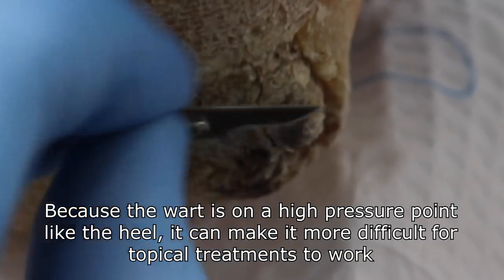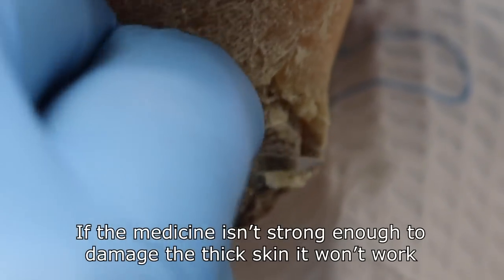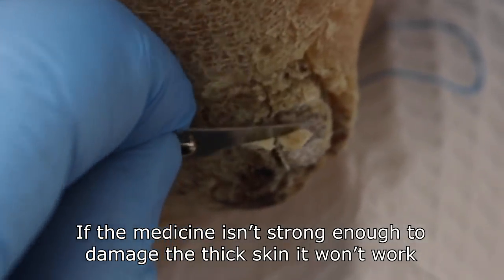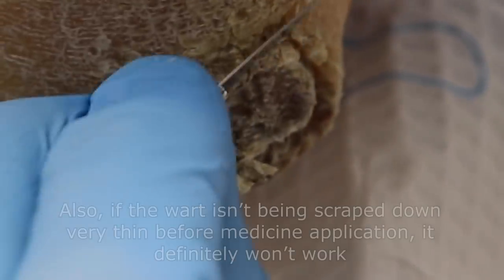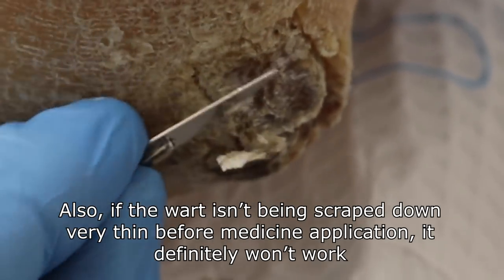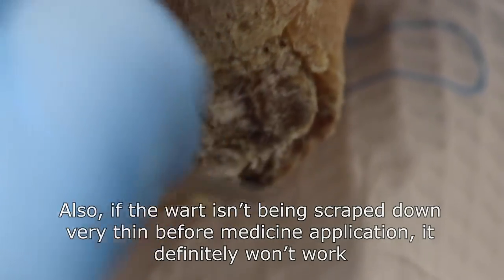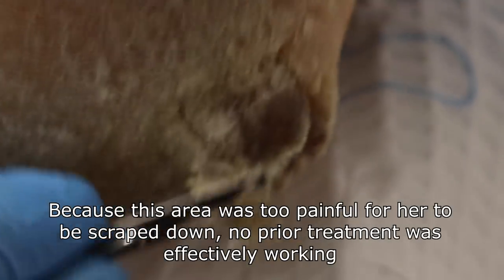Anything painful here? No. You okay? Okay, awesome. So I just want to make it a little bit flat before we get to the removal. And then we can also find out if there's any area that's not completely numb.